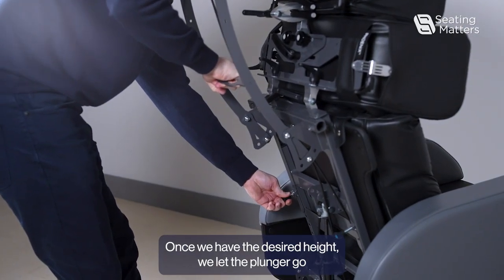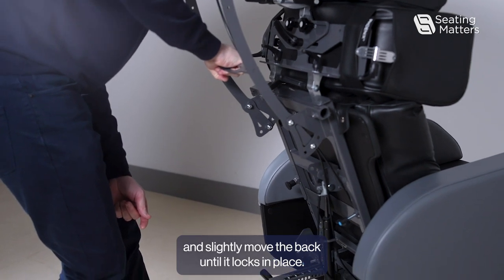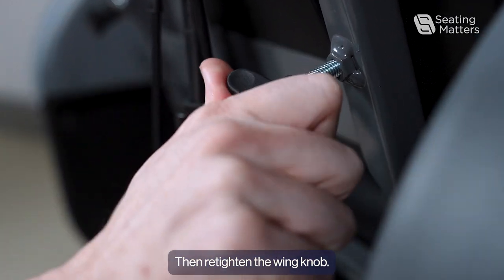Once we have the desired height, let the plunger go and slightly move the back until it locks in place, then retighten the wing knob.